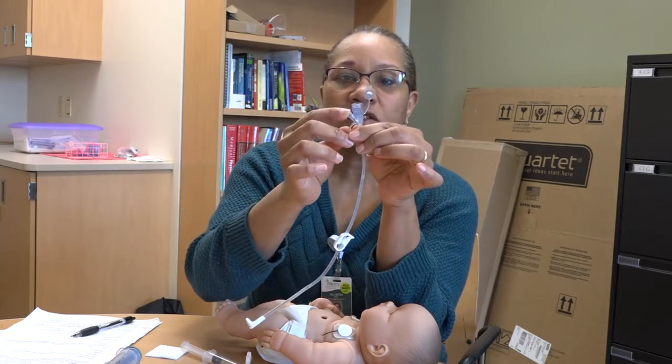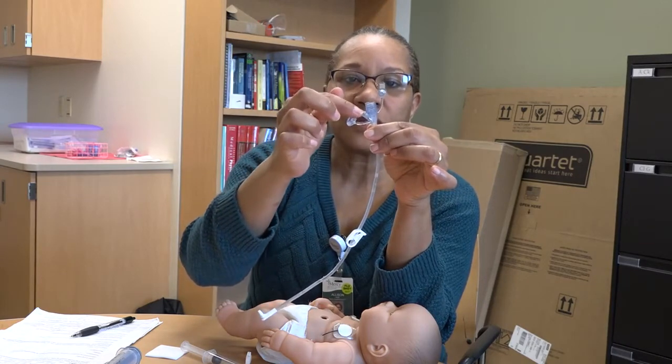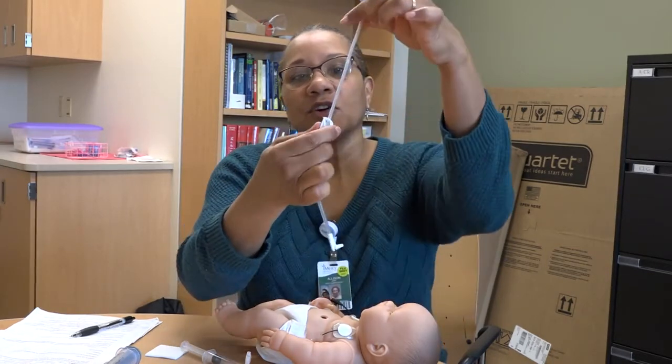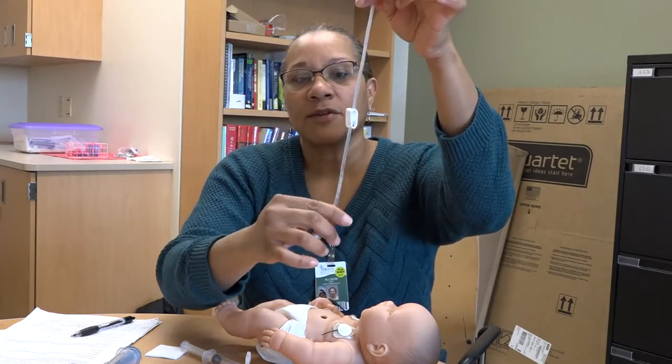This is the medication port, so if you have medication to give, you can place it in this port, but usually that is closed unless you're using it. And then you have the clamp that you can open and close, and that's what controls the formula going down through the tube.